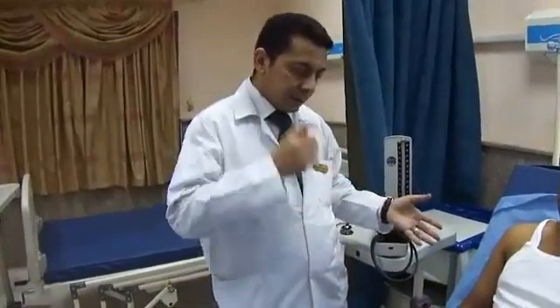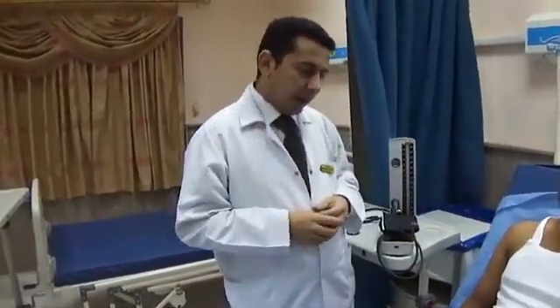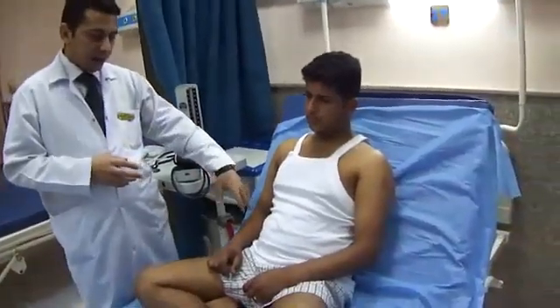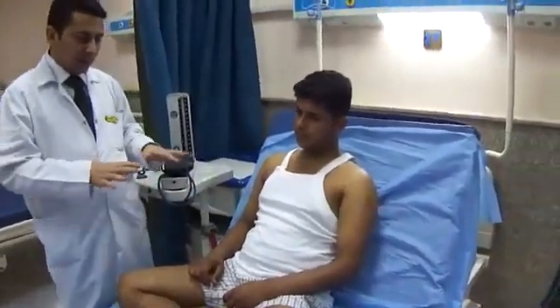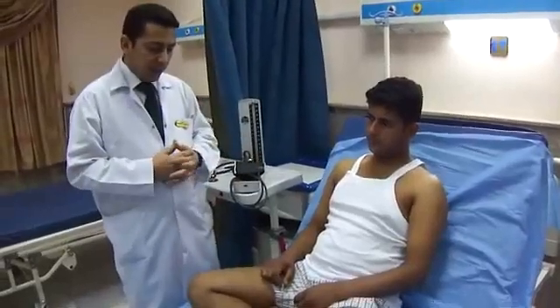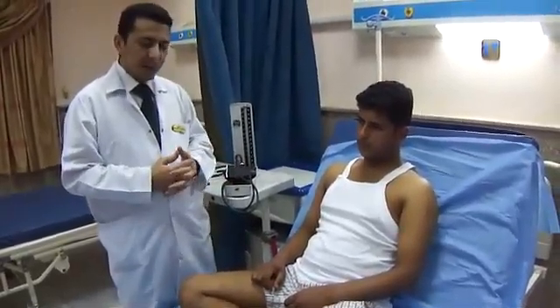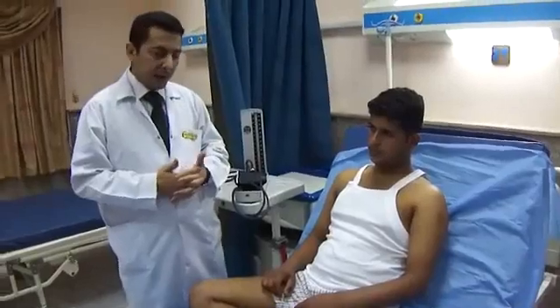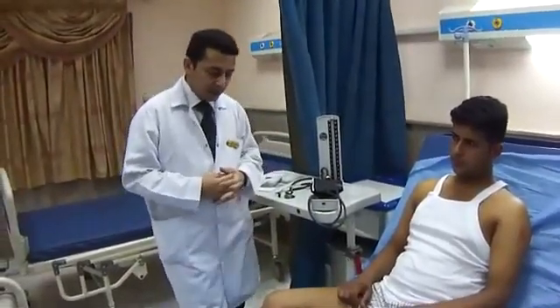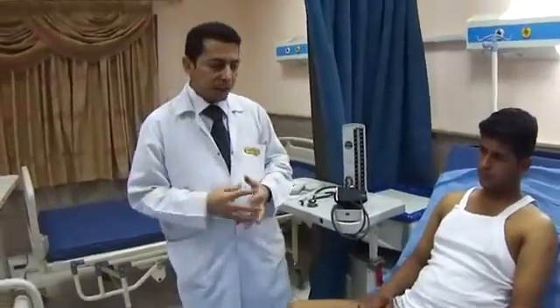Assessment on one side should be followed by assessment of the contralateral side — that is to say, first measure the right side and then the left side, taking the highest reading of them. There may be a difference in blood pressure of less than 10 millimeters of mercury, which is normal, but the highest reading is taken.